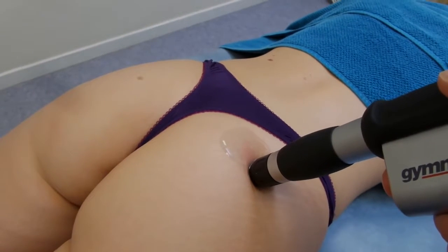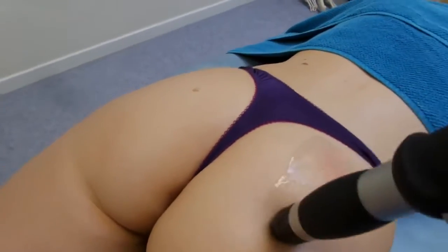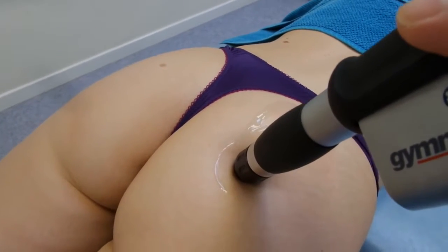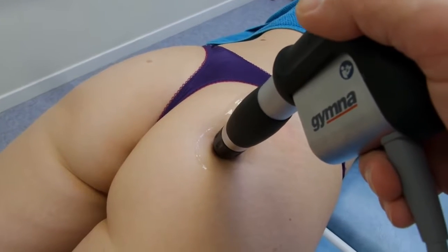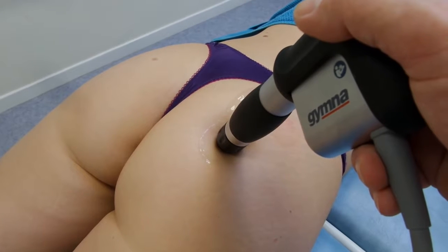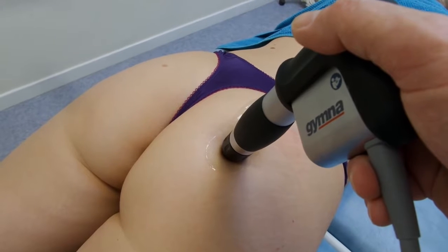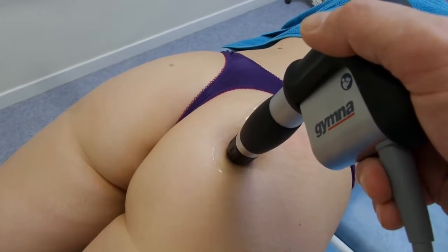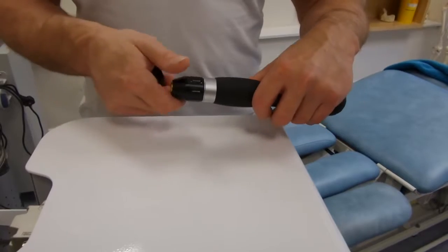Okay, we run 200 shocks. And move down to the 3rd spot and apply the treatment for 200 shocks to the 3rd spot. Once we've applied the treatment, you can see the redness, the erythema from the deep impact applicator.